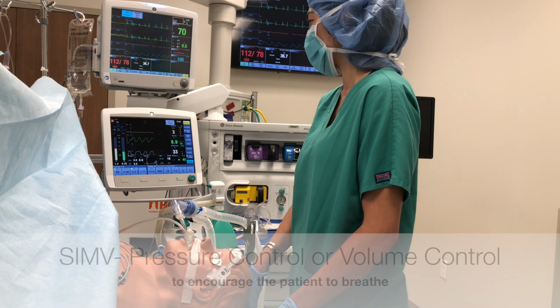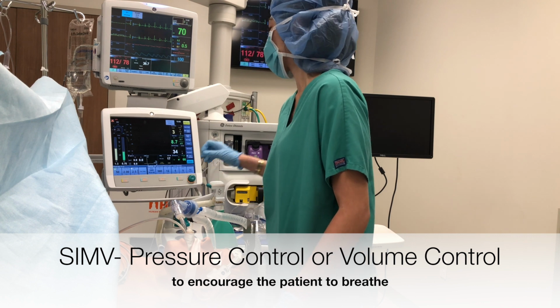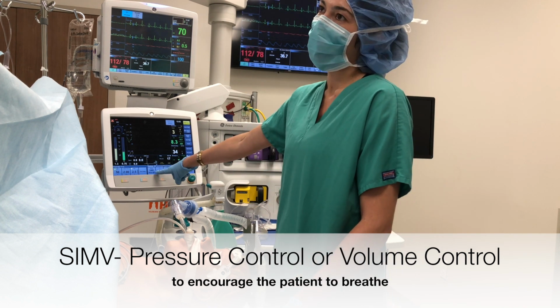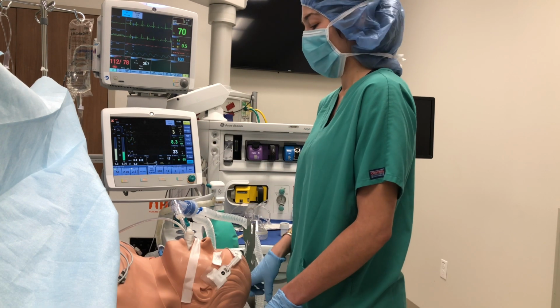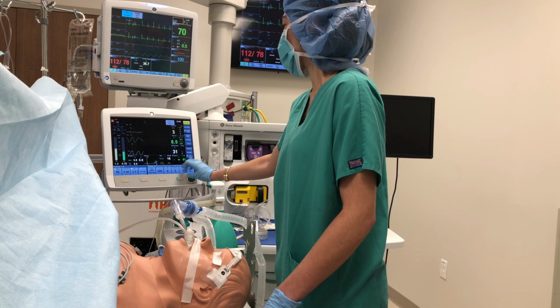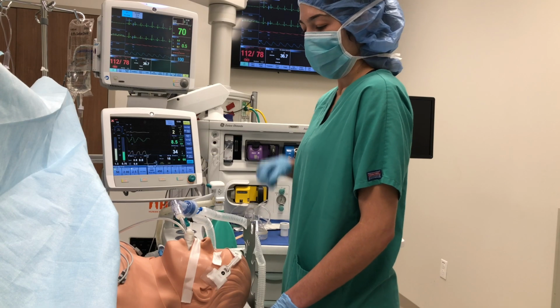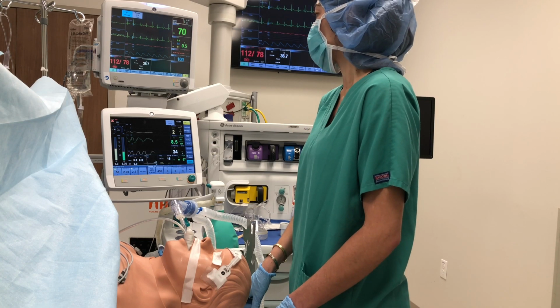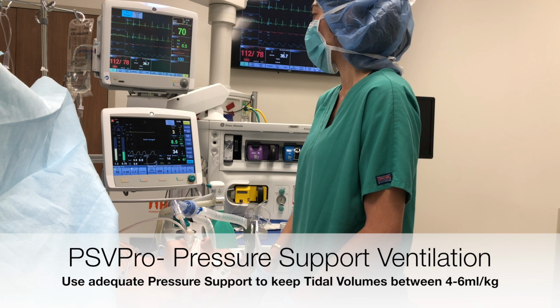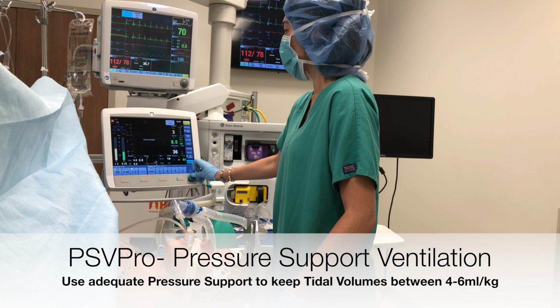Change the ventilator settings to synchronized intermittent ventilation, pressure control, or volume control to allow the patient to take their own breaths when ready. Decrease respirations or tidal volume to build up end-tidal CO2. Once the patient is breathing on their own, switch the ventilator to pressure support ventilation and assist his or her ventilation.